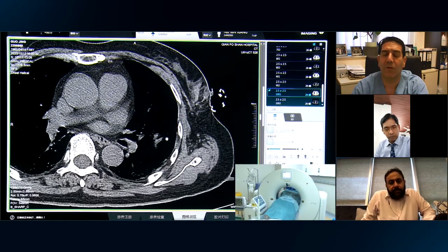Yeah. Congratulations for a very nice ablation. Thanks. Congratulations, well done. Can we answer the question about possible complications during ablation?